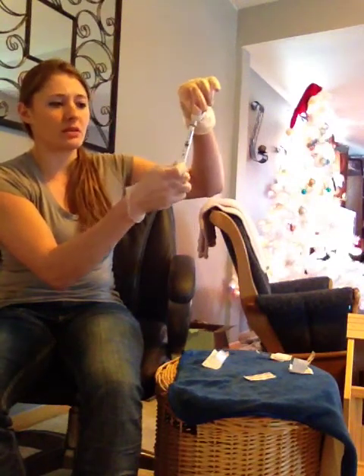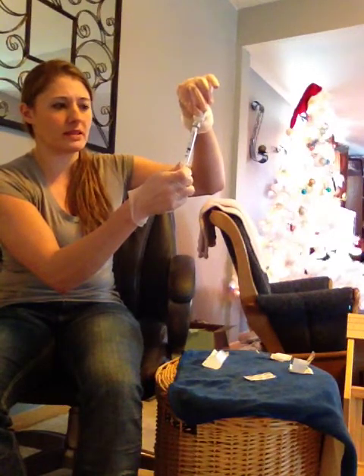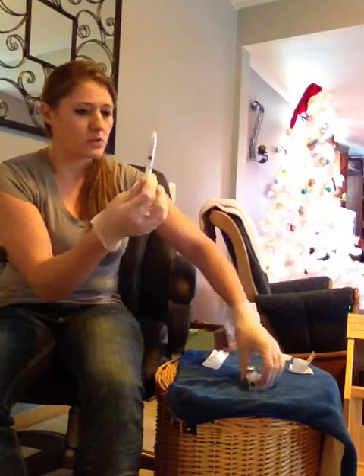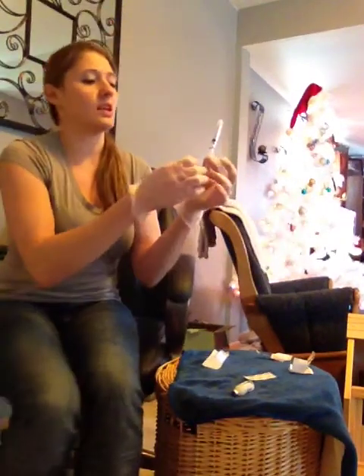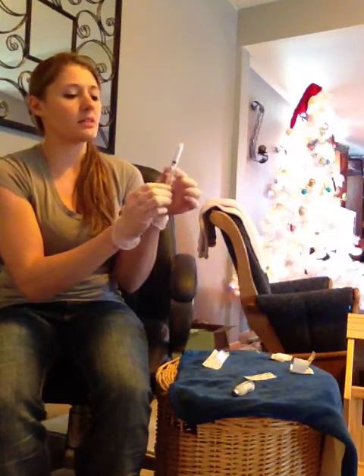And we do this because if you don't replace the fluid that you take out with air, it'll cause a vacuum inside the vial. So we now have our 2 mils of pretend solution in this syringe. So what we're going to do is use the Z-track method.